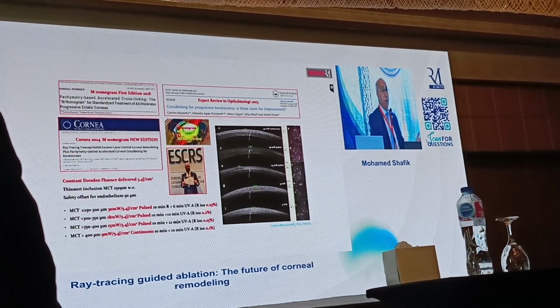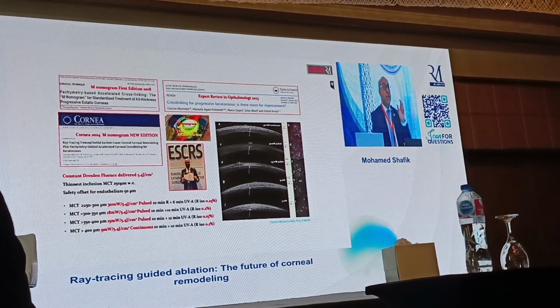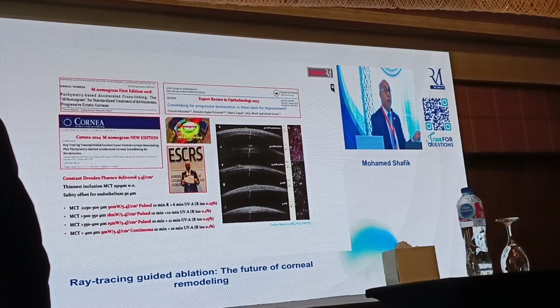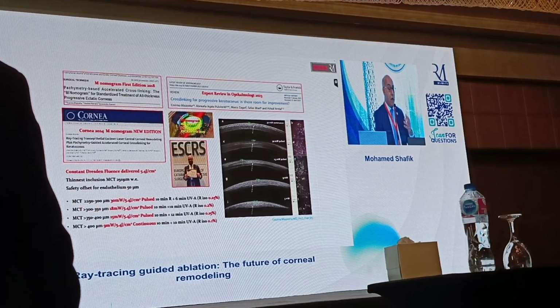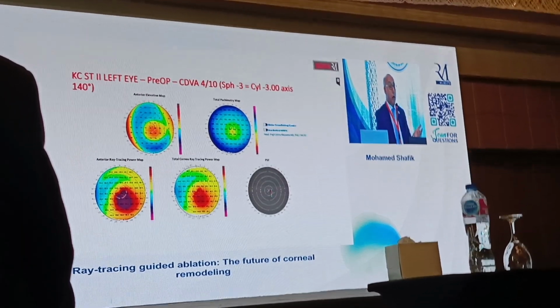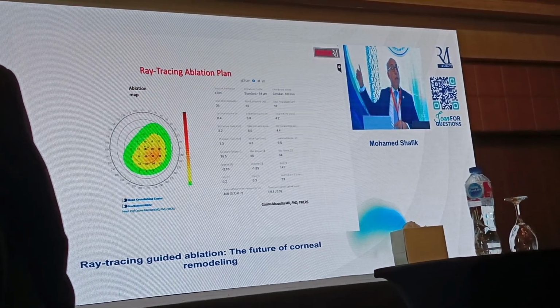And we've seen the nice and beautiful lecture of Cynthia Roberts, how the zone is different in the keratoconus. We are targeting the zones of stress and the thinnest location, so you don't have to make a full corneal cross-linking.